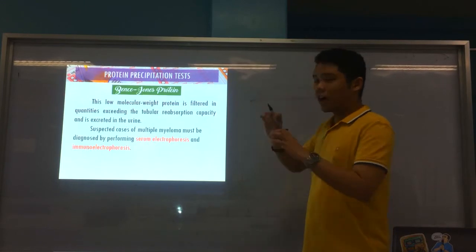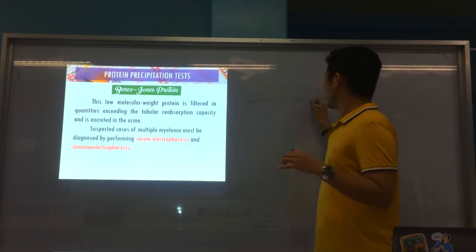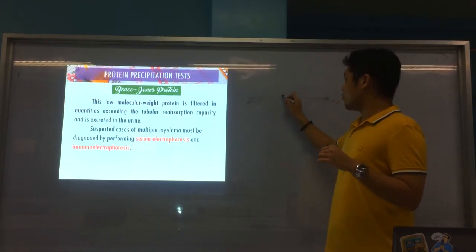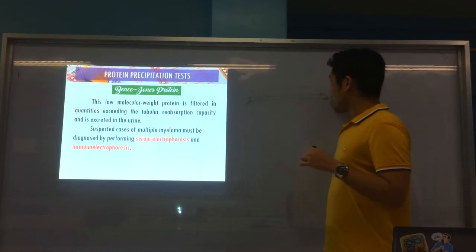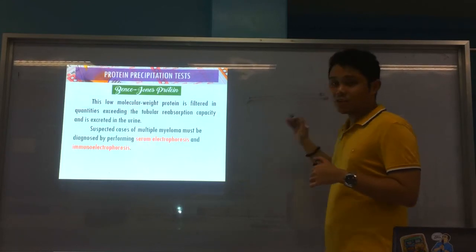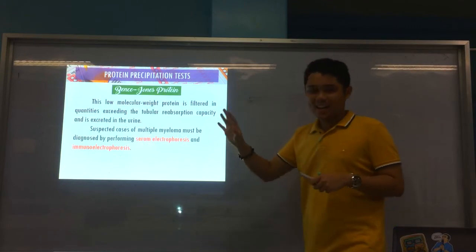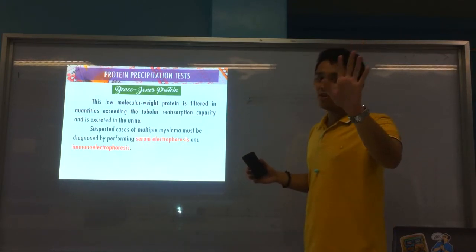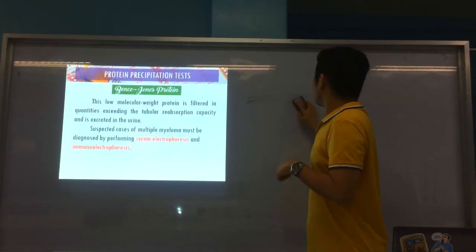So, you charge with electricity, from here to there. And what happens is your fluid will move. Okay? It moves from one end to another end. Then the protein components get separated, depending on the different regions in your electrophoresis. Okay? Alright, so, again, this is in a nutshell. It's very superficial, not an in-depth discussion. Okay? But again, that's for Bence Jones protein.